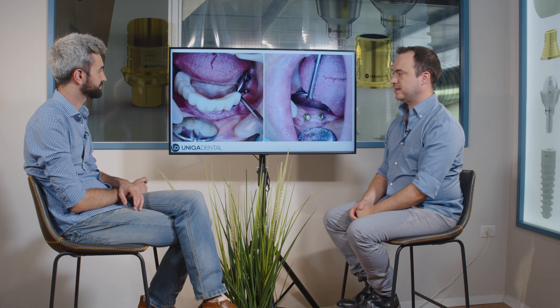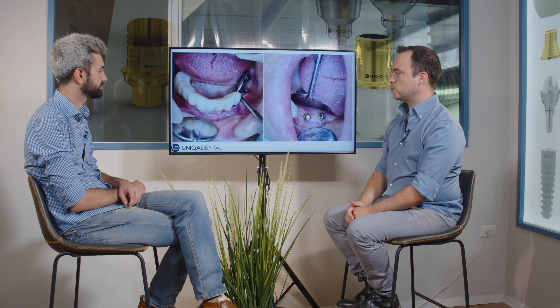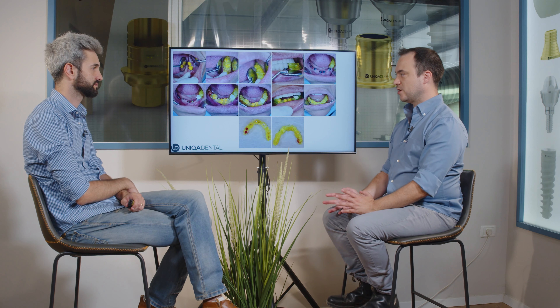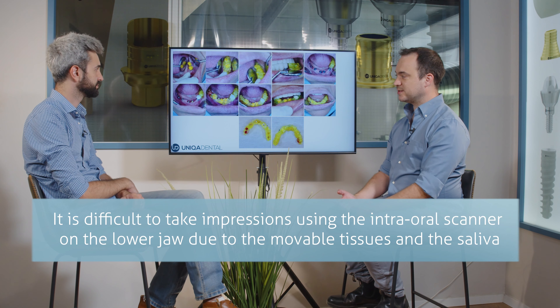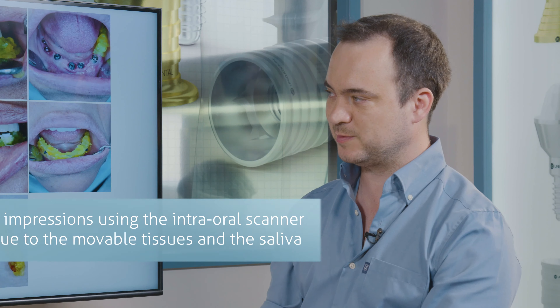On the lower jaw, the patient had a bridge — kind of partial — because the bridge is from the canine to the molar on the opposite side. We want to take impressions on the lower bridge. Even though we took impressions using a scanner on the upper jaw, on the lower jaw it's a different case because it's very difficult to take impressions using an intraoral scanner, because of all the movable tissues — the tongue, the lips, the movable gingiva, the unkeratinized gingiva. It's a problem taking impressions.